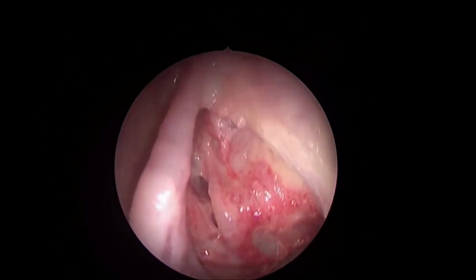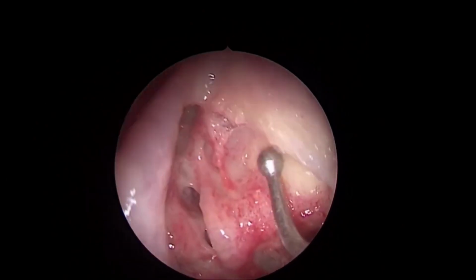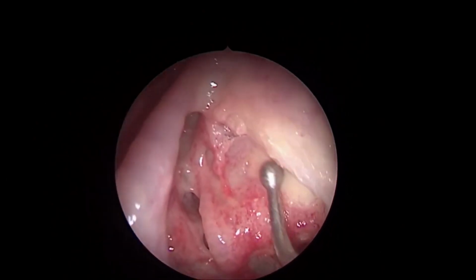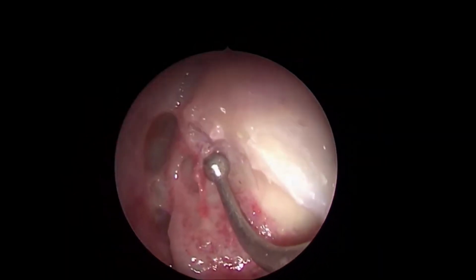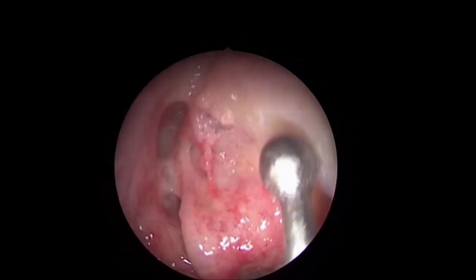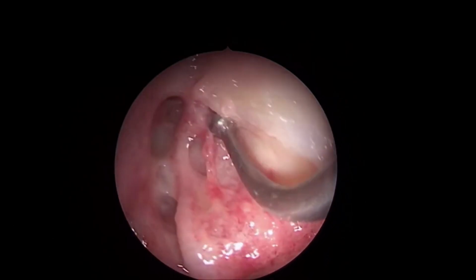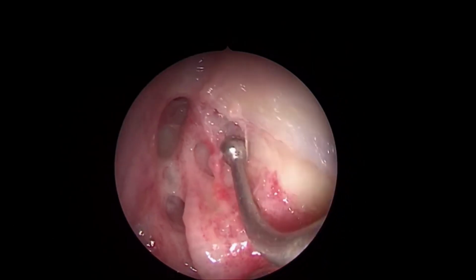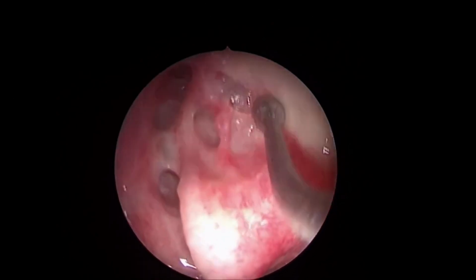So, the landmarks for the frontal sinus, what I believe, this is the medial orbital wall we have seen. Now, with the 70 degree telescope, if I keep my medial wall all the time in view, wherever up I go, and don't cross this limit, I will never damage the orbit. As simple as that.